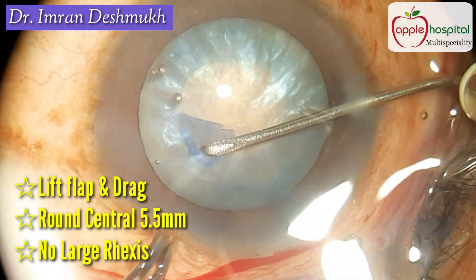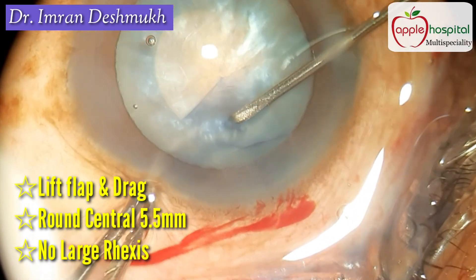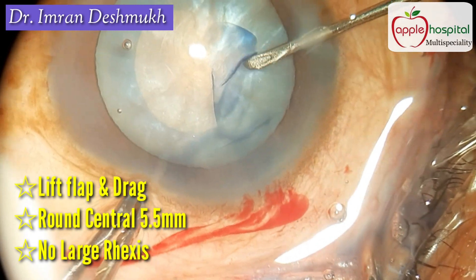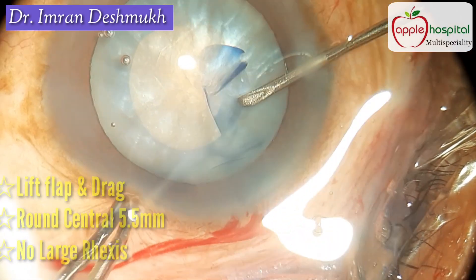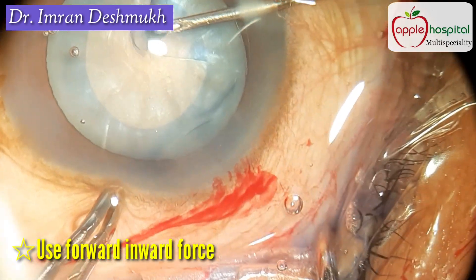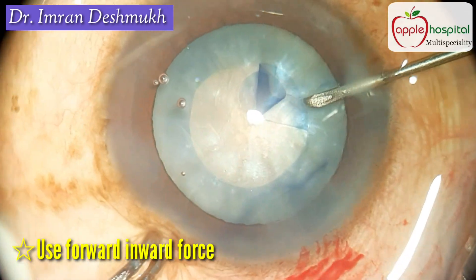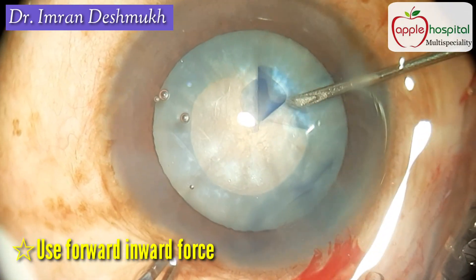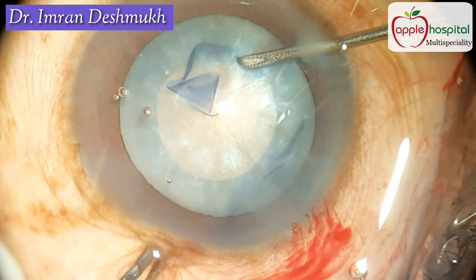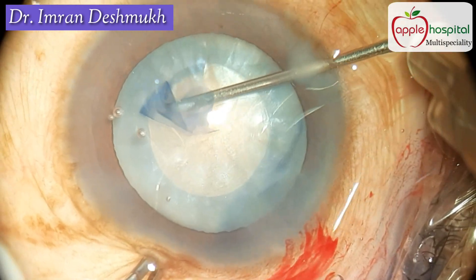Create a central 5 to 5.5 millimeter size rhexis. Do not make a large rhexis — remember, a small rhexis can always be enlarged later. So it is always better to make a 5 to 5.5 millimeter rhexis. Use a forward and inward force whenever you're dragging the anterior capsule, and drag it in such a way that you get a round circular rhexis. Believe me, this is a very important step — if this step goes fine, the rest of the surgery becomes very easy.